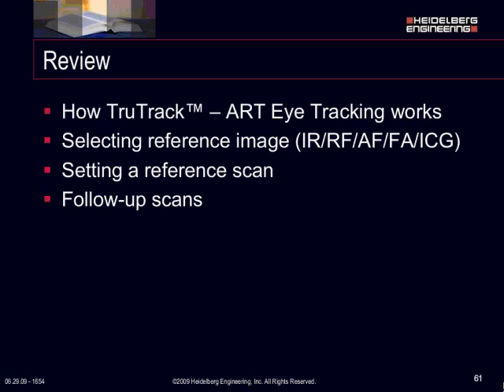And then setting the reference scan, being sure to do that so that you can do your follow-ups, and going through all of your follow-up scans, and making your prints so that your doctors can follow and track those patients over time.